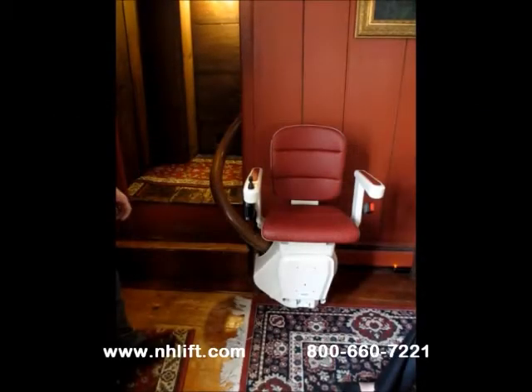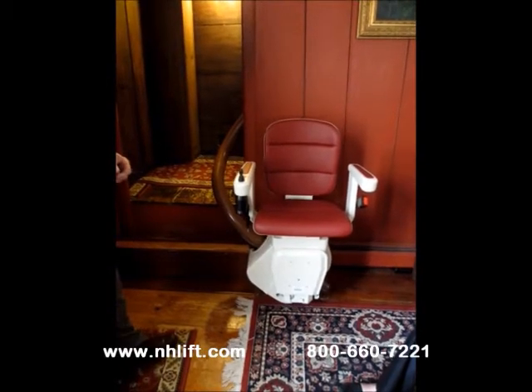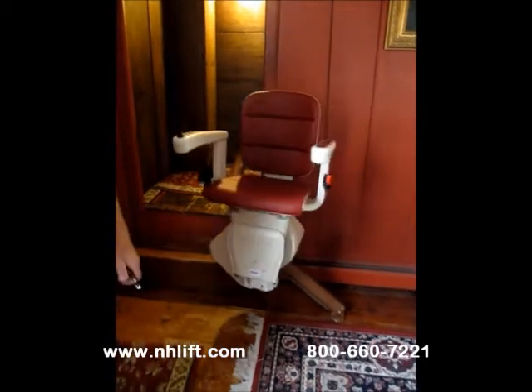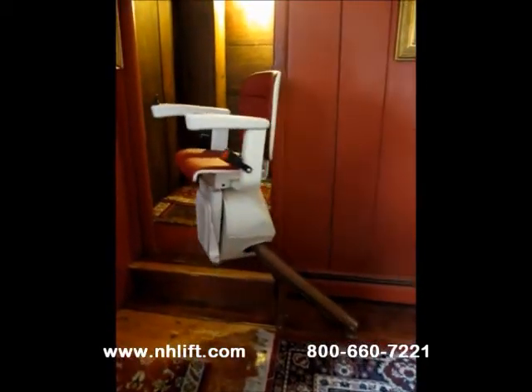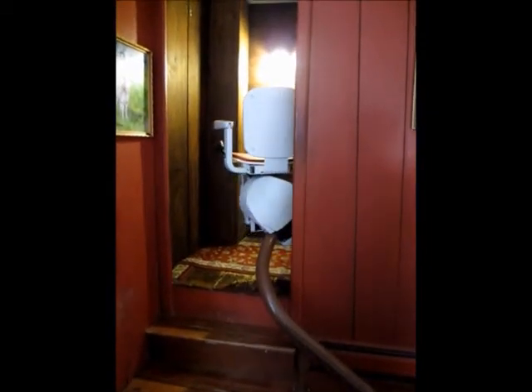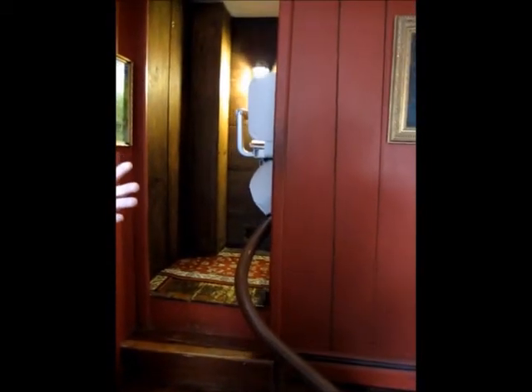This is the Stirling Freelift, a monorail curved stairlift for any stairway requiring a custom installation. As you can see, the lift travels freely through virtually any stairway passage, regardless of how narrow.